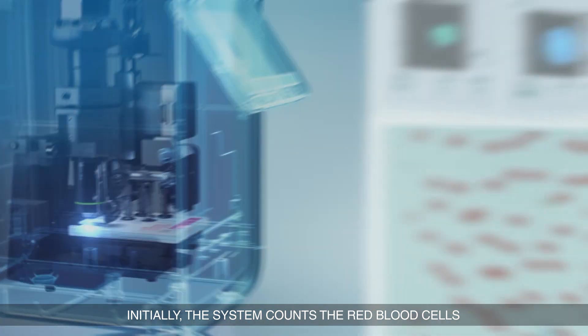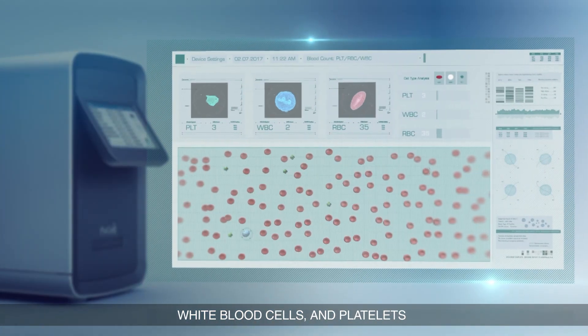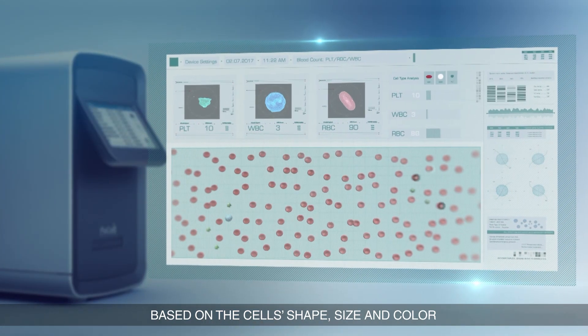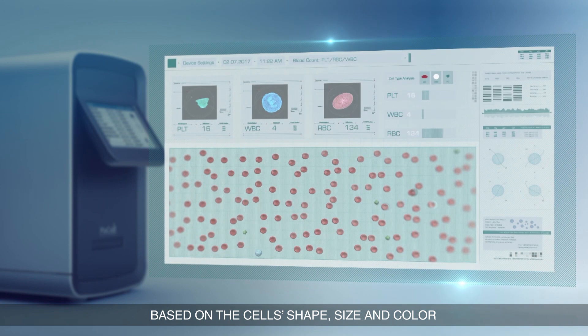Initially the system counts the red blood cells, white blood cells, and platelets based on the cell's shape, size, and color.